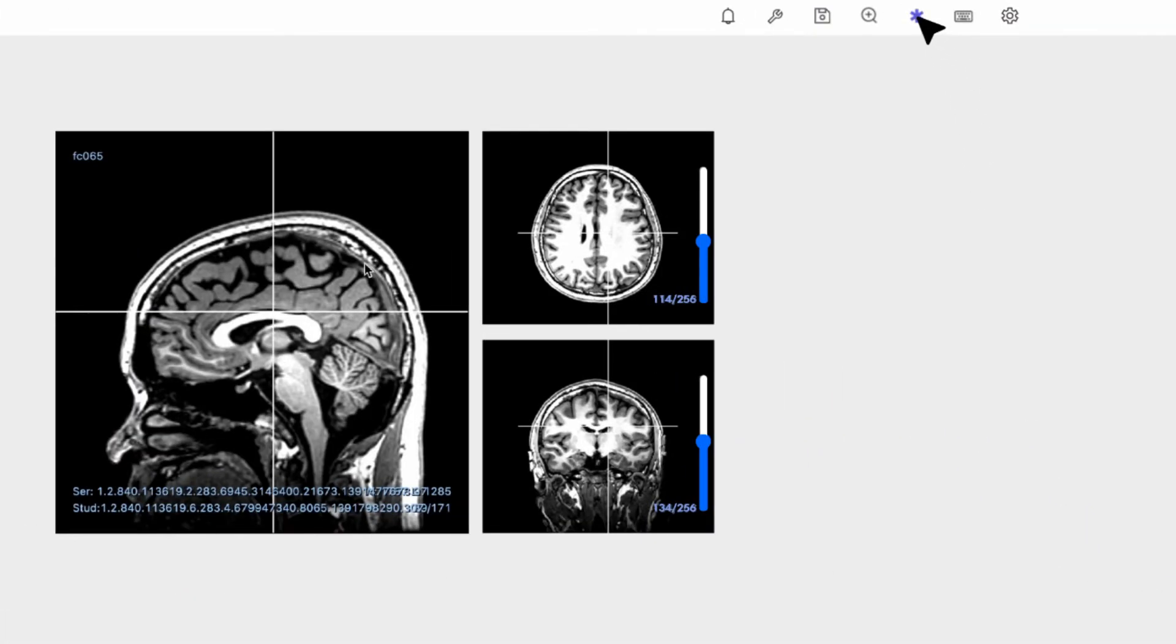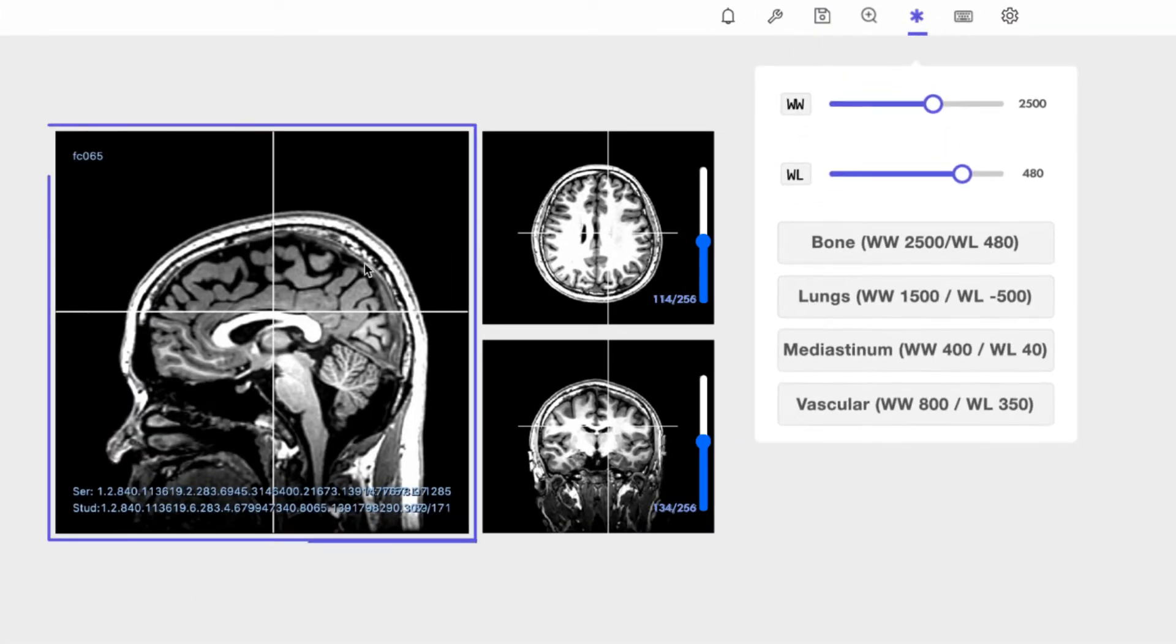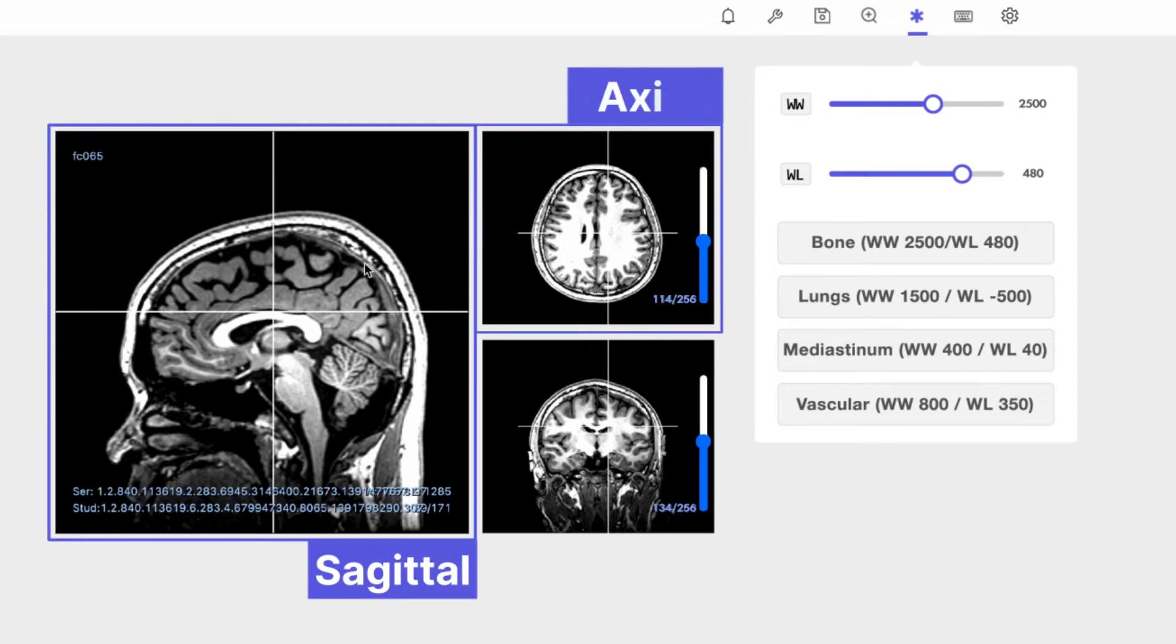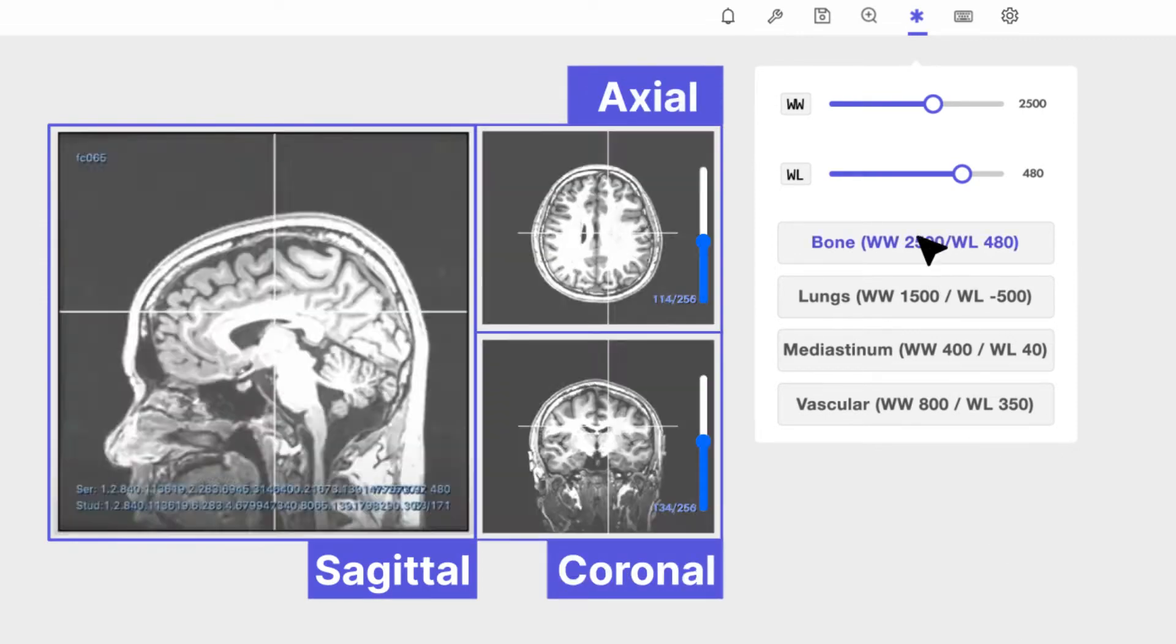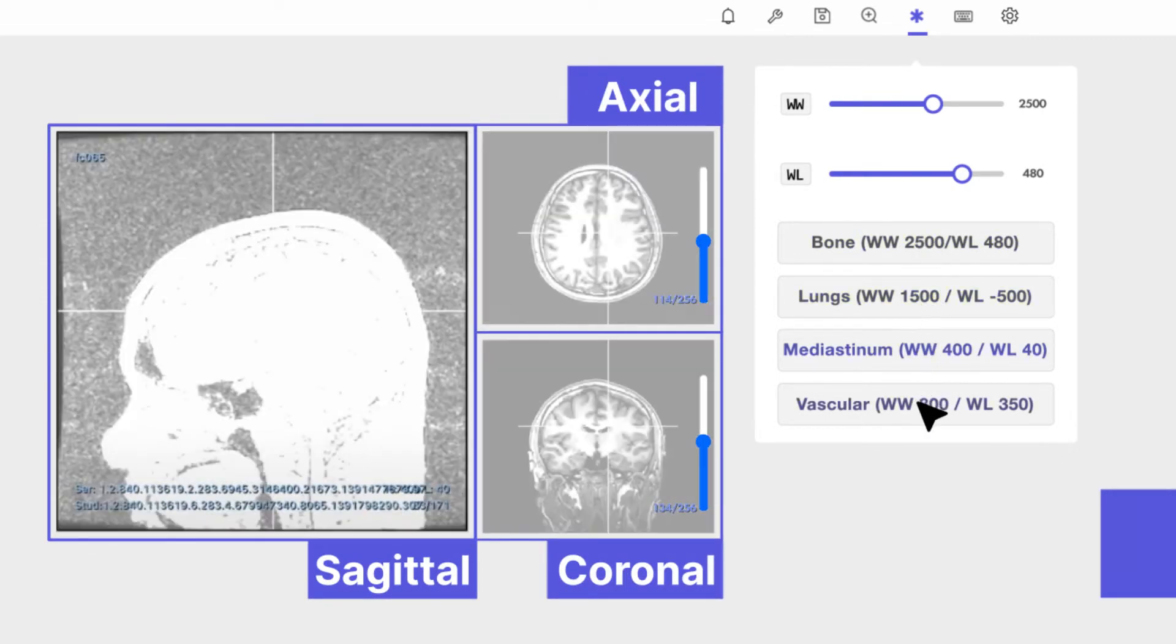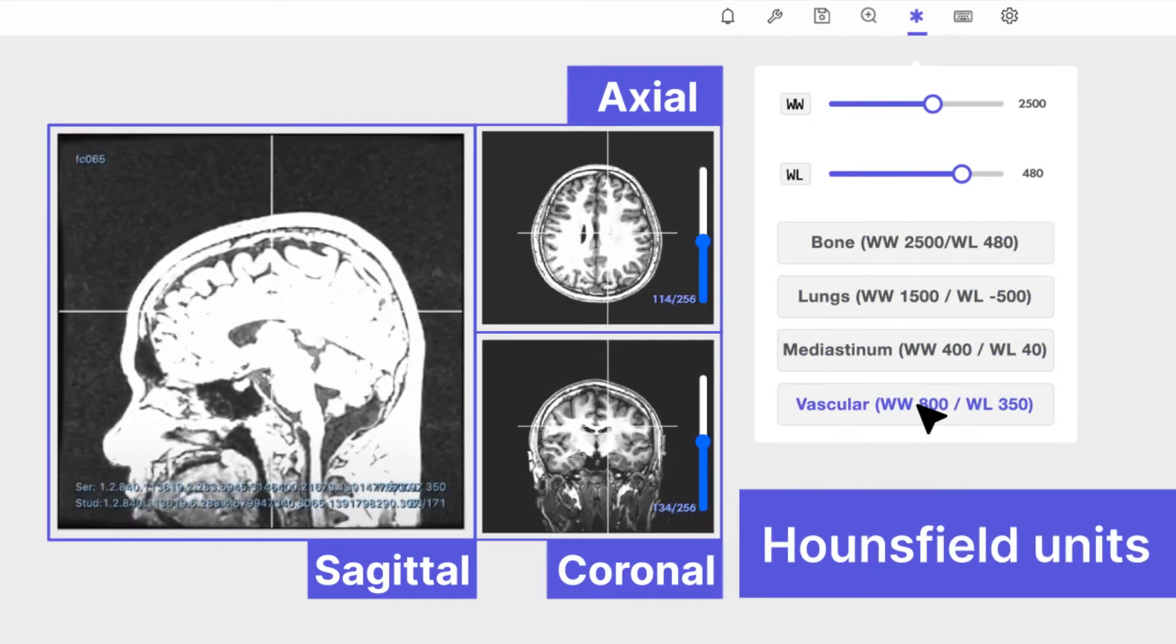It supports 3D views in three planes: sagittal, axial, and coronal, with window levels defined by Hounsfield units.